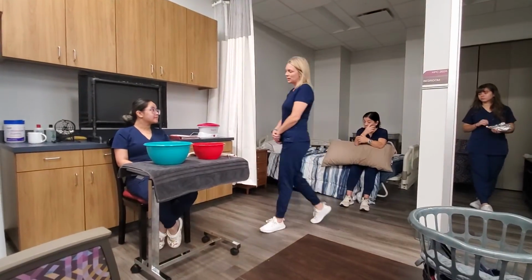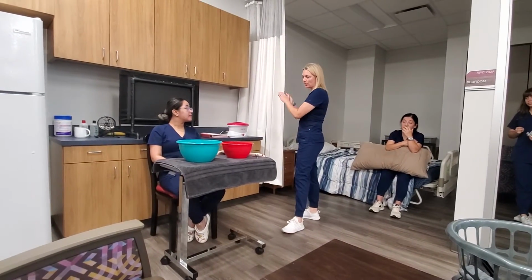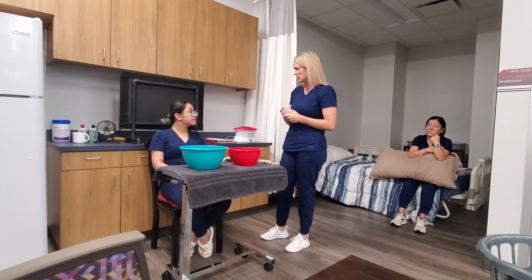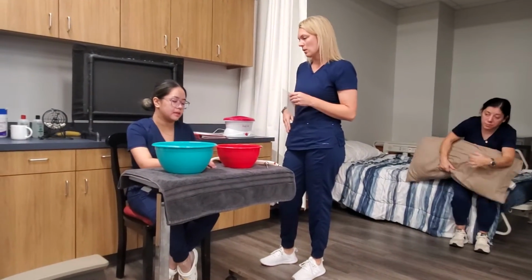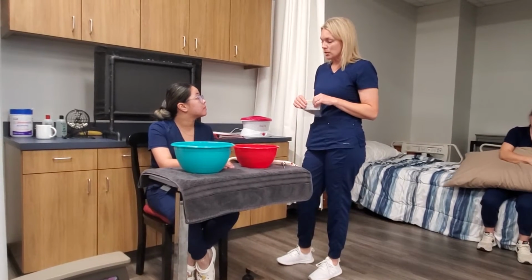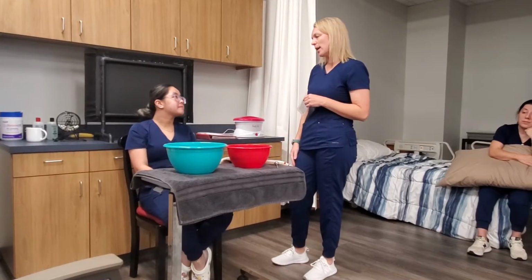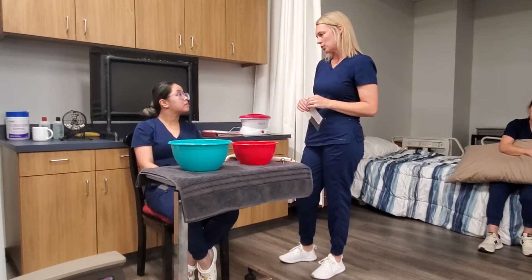Good morning, Miss Wynn. How are you? Good. I'm Stephanie. I'm going to be the COTA that's working with you today, okay? So I saw that you have a really sore right wrist. Oh yes, there's some pain and stiffness in the wrist and my finger as well. Okay. Alrighty. So we are going to do a functional activity later on together. I know that you really love to paint, and so I want to get you back to that. But before we start, I want to try something called a contrast bath.